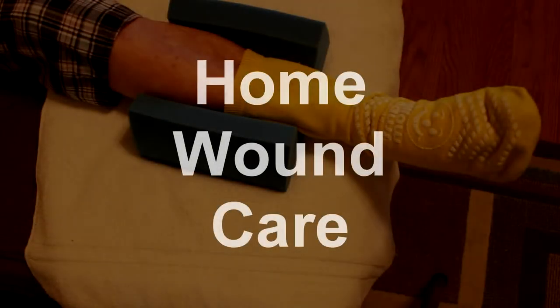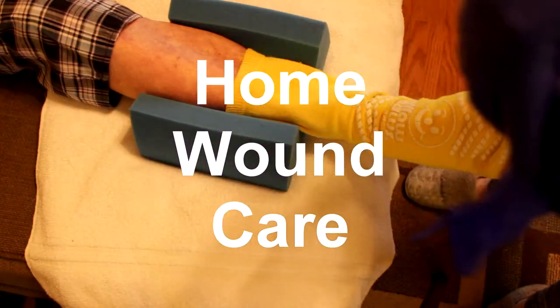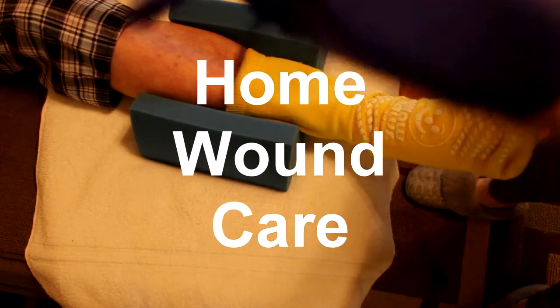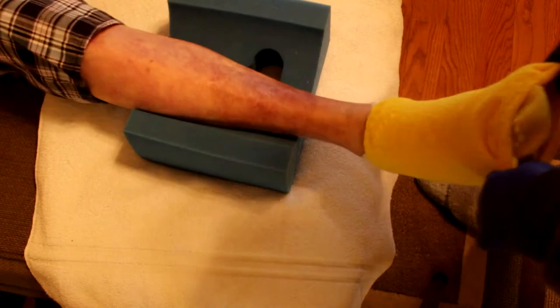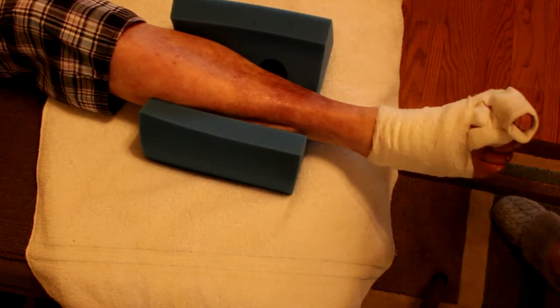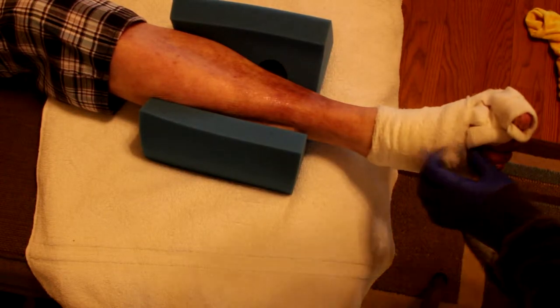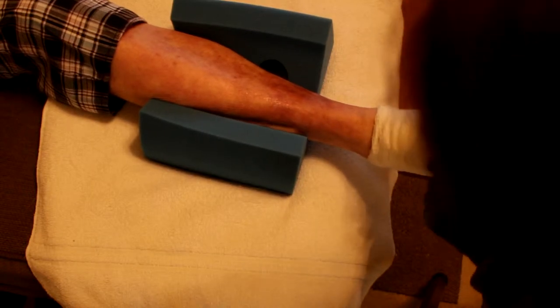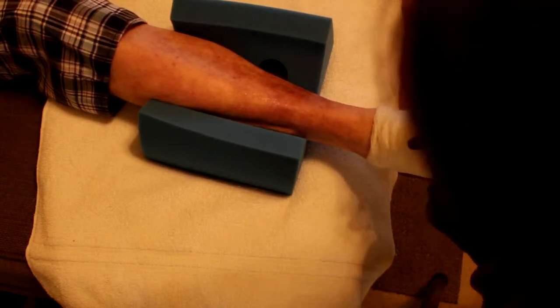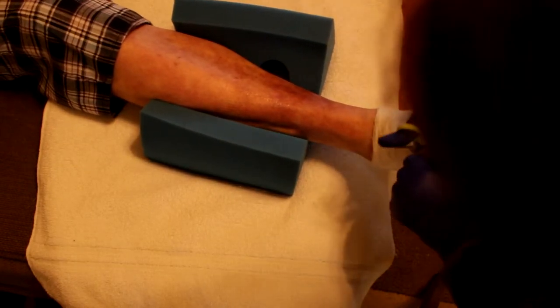The very first thing I have to do before wound care every day is put on gloves. He just took a shower, and when we wrap his foot up in plastic sometimes a little water still gets in, so we always wait to do wound care after a shower — just in case anything got wet, we want to make sure none of his dressings are wet.